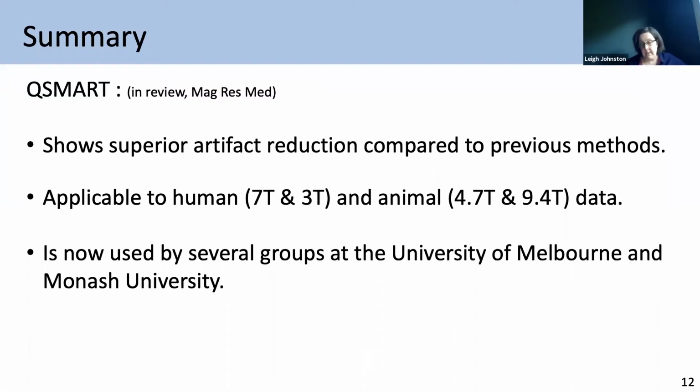We've tested it at 7T. We've tested it also at 3T, where the phase information isn't as good. And you think, well, what's the relationship there? So remember that you've got a resonance frequency, which is telling us how fast our signals are precessing, okay? What's its angular frequency? At 3T, if the protons are precessing slower and the bulk magnetization is oscillating slower, your off-resonance differences aren't as pronounced. And if they're not as pronounced, they just don't look as good. You can't get as much information out of the signal.